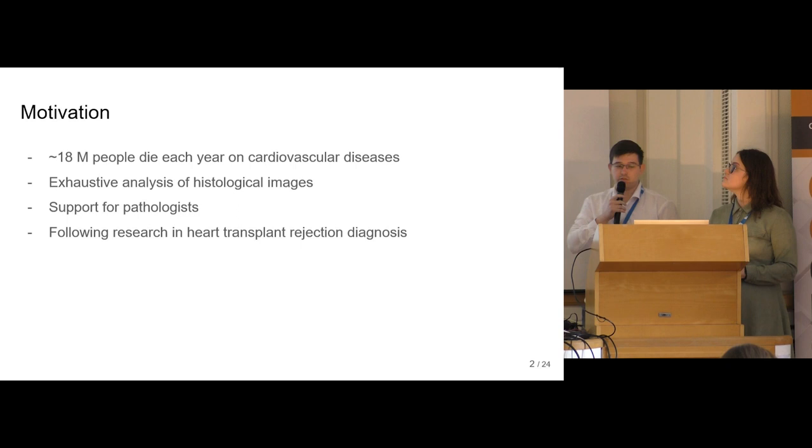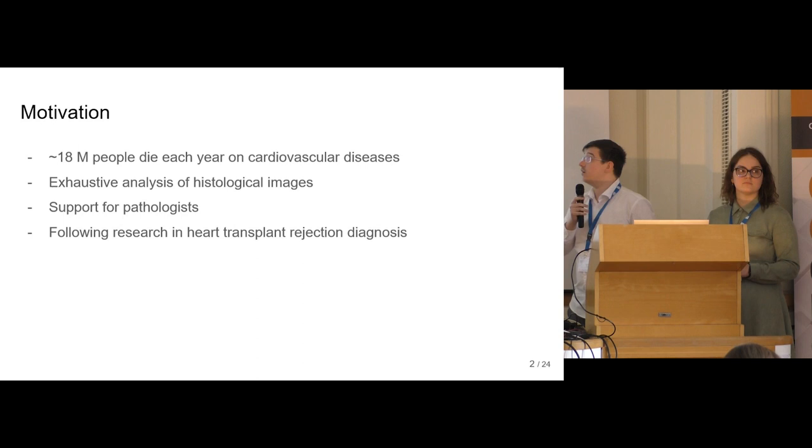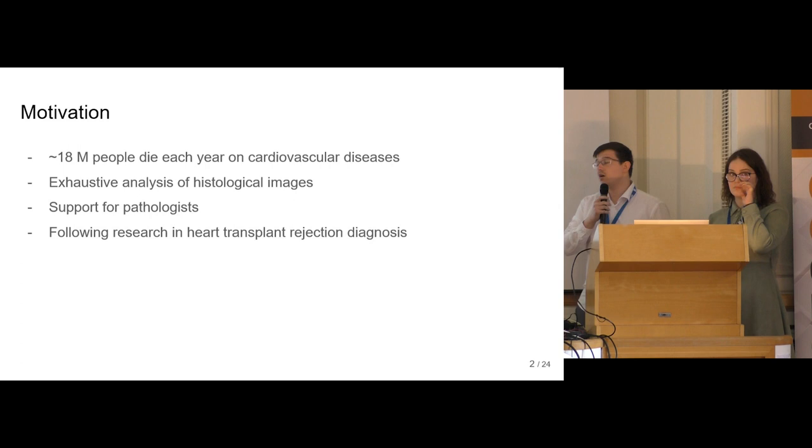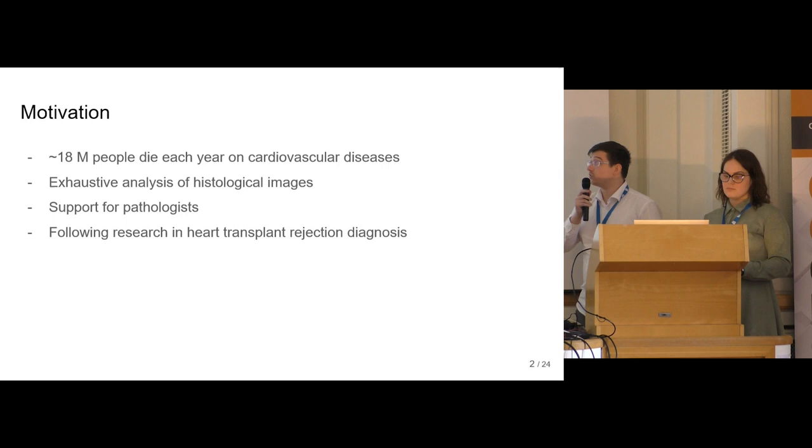The motivation for our research is primarily that up to 18 million people die each year of cardiovascular diseases, which includes heart or blood vessel diseases, and a cardiac biopsy is an effective way to identify possible issues with the patient health status. After tissue collection and digitalization, the samples must be viewed by the doctor and evaluated manually, which can be a challenging and time-consuming task.